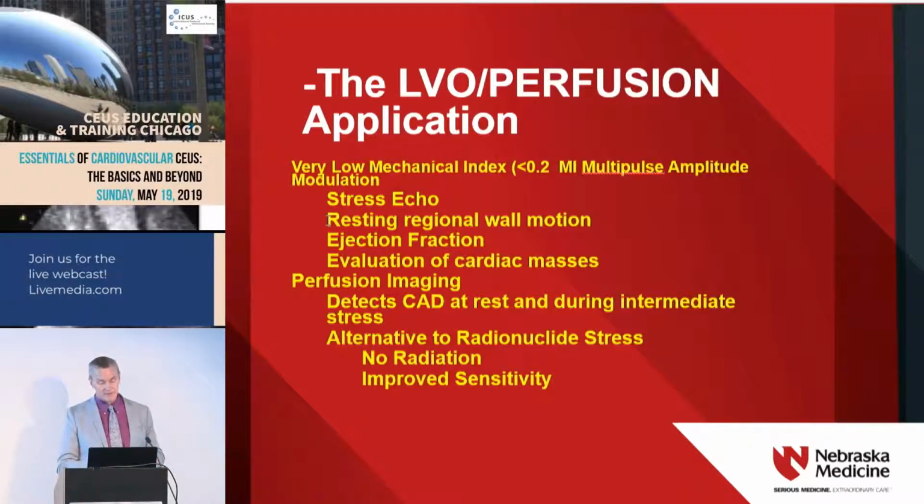That's the thing about echo, it just keeps getting additional benefits, okay? Hopefully within 5 years, we'll be able to do strain with contrast, because strain is great with great windows. Strain is impossible with bad windows, in our opinion. And we need something that helps us get a better window so we can do strain. So I think contrast has a capability of doing that. Maybe that post-high MI impulse, remember, that's when we clear the myocardium. That may be the ideal time to do a strain if we can get the software to work for that, because we have one cardiac cycle where even in normal perfusion, we usually have almost totally black myocardium. It would be perfect for getting the bubble interference out of the way of the myocardium for strain analysis, and giving us the endocardial border delineation that we need to make sure the tracking mechanisms stay where they should.